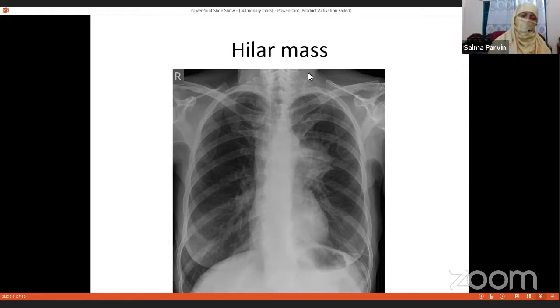But what is happening here? Is it really towards the right? The mediastinum should be on the right side more than usual, since the patient is rotated to the right. Even with this scenario, we are getting most of the mediastinum on the left side. What is normal? In a normal mediastinum, one third is to the right and two thirds to the left of the midline. But here, there is something different, which should not be in this rotated film. So this mediastinum is really shifted to the left.